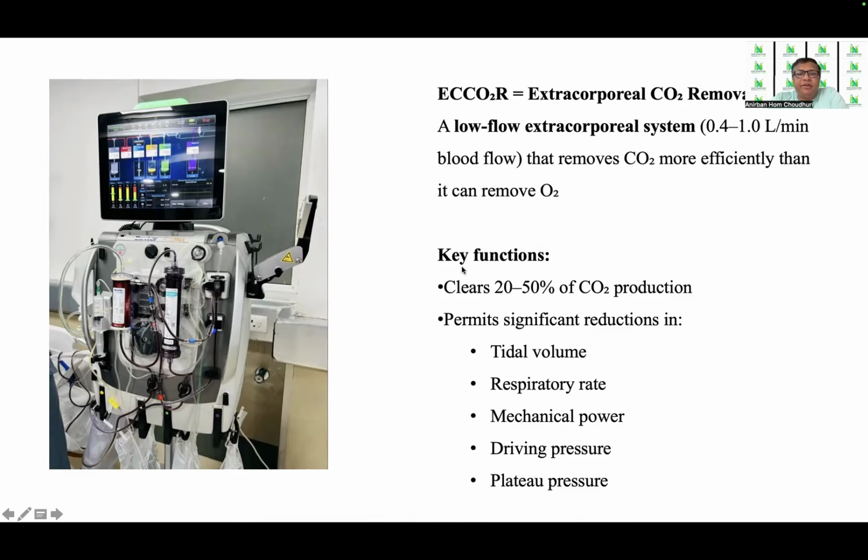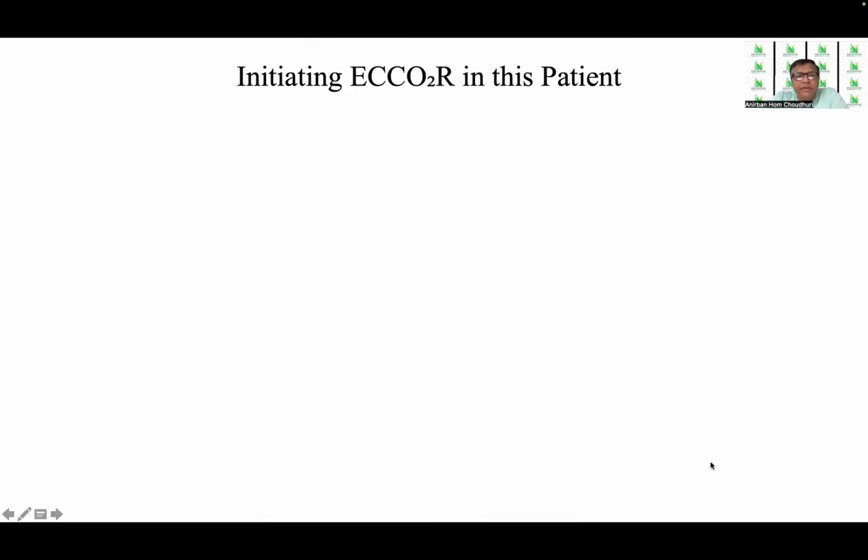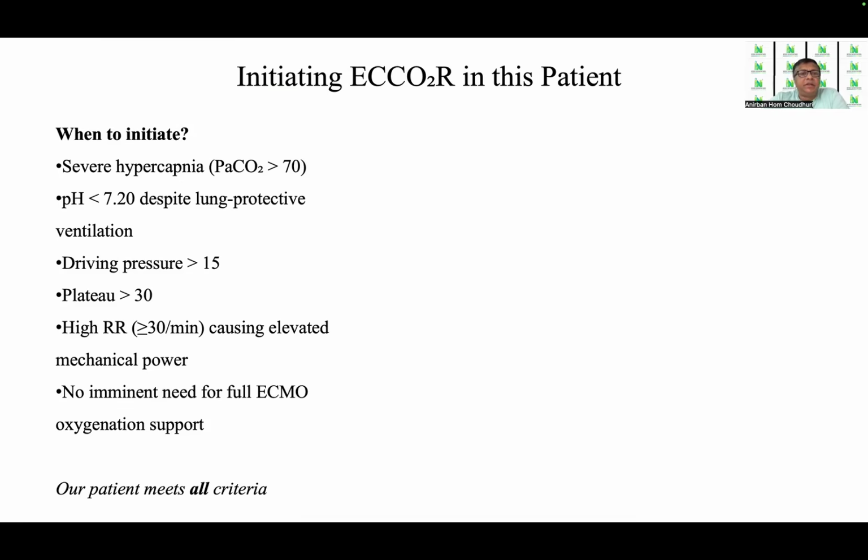As you can see on your left, it performs the key function of clearing 20 to 50% of the CO2 production, and permits significant reduction in tidal volume, respiratory rate, mechanical power, driving pressure, as well as plateau pressure. Now, how do we initiate ECCO2R in this patient?